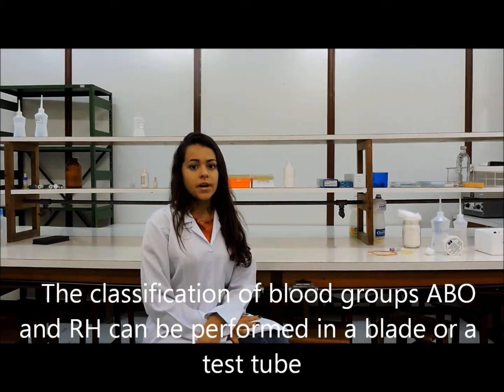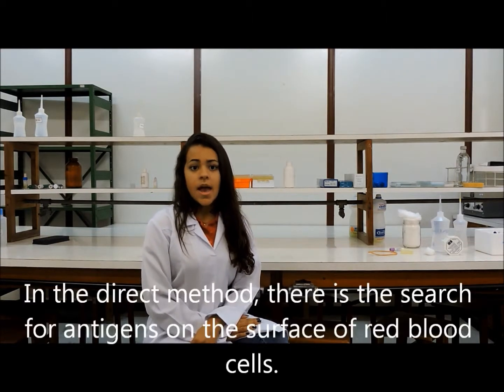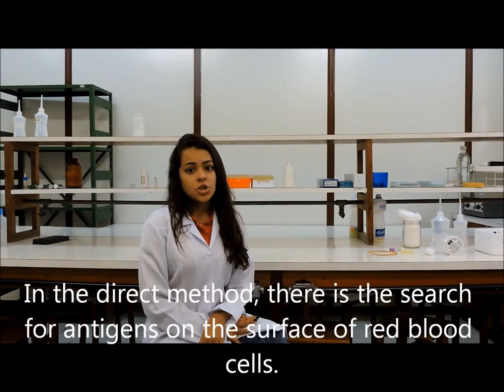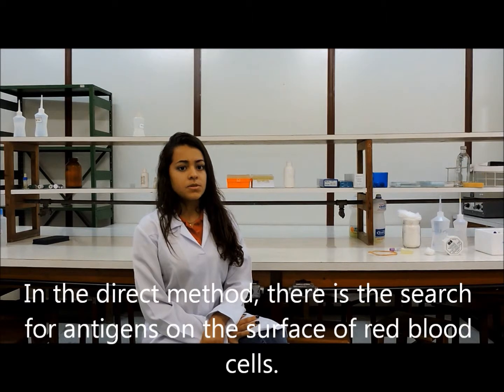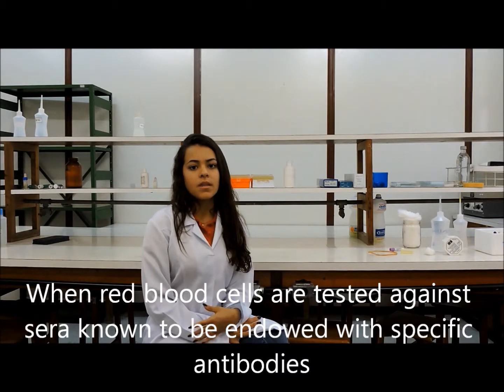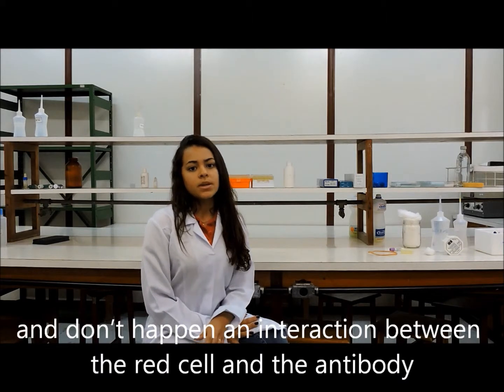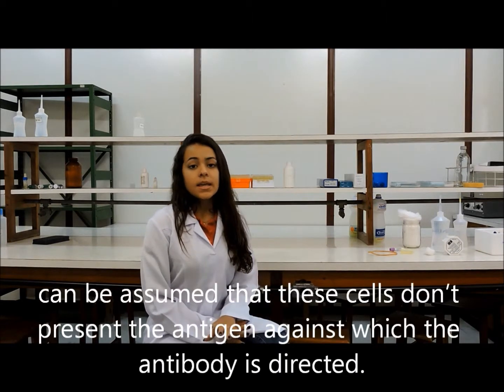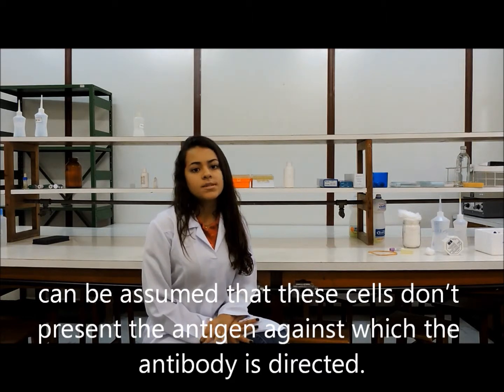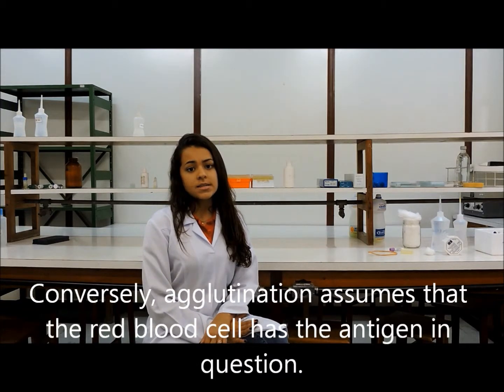Groups ABO and RH can be determined on a slide or in a test tube. A direct or an indirect method can also be used. In the direct method, there is a search for antigens on the surface of red blood cells. When red blood cells are tested against sera known to contain specific antibodies and there is no interaction between the red cells and the antibody, it can be assumed that these cells don't present the antigen against which the antibody is directed. Conversely, agglutination indicates that the red blood cells have the antigen in question.